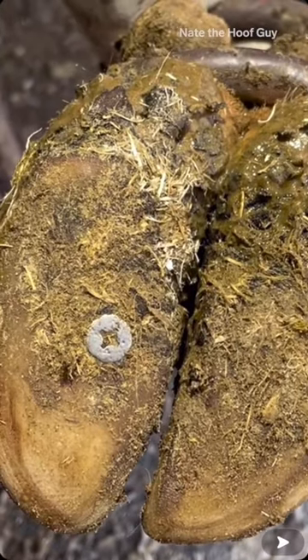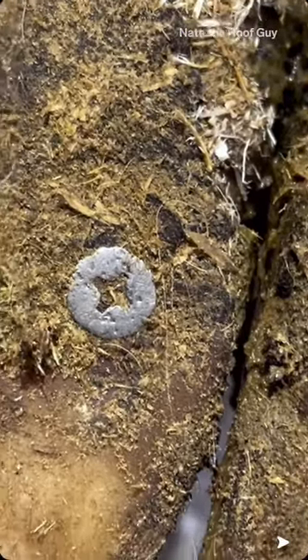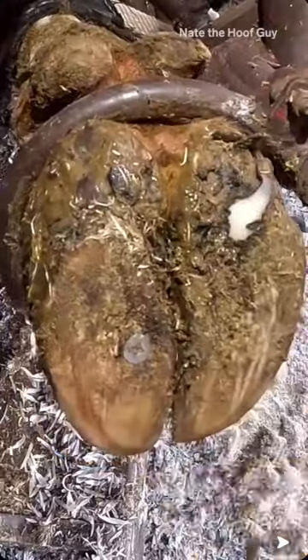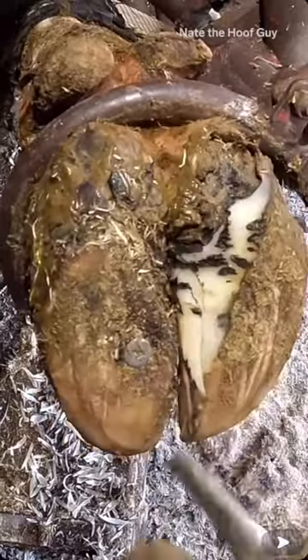What we're looking at here is a cow that has stepped on a screw, and at this point I'm not really sure how deep this screw is embedded, so that's what I have to investigate. Is there pain here? Is this a long screw that's all the way through that hoof capsule and into the corium, or is it just a surface problem?